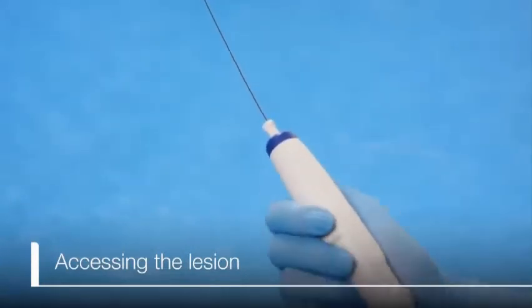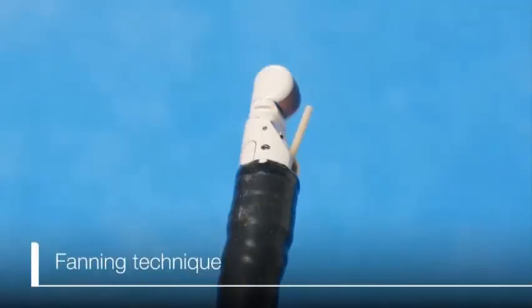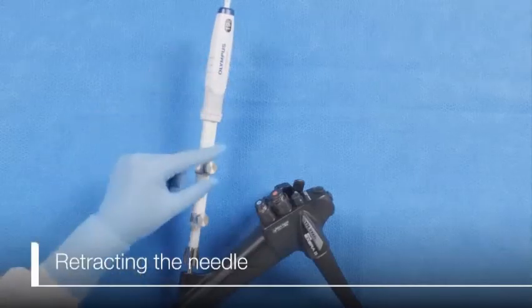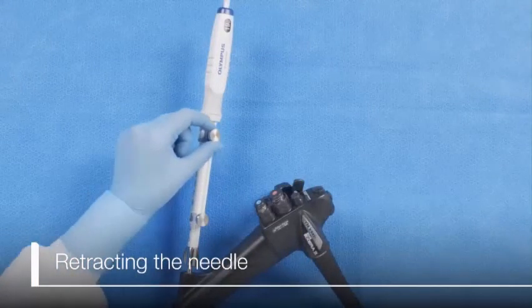The physician may use the fanning technique to sample as much tissue as possible from the lesion. This may be done by elevating and lowering the elevator of the echoendoscope. Once the physician has finished obtaining the tissue sample, he will pull back the needle handle to withdraw the needle from the target area into the sheath.